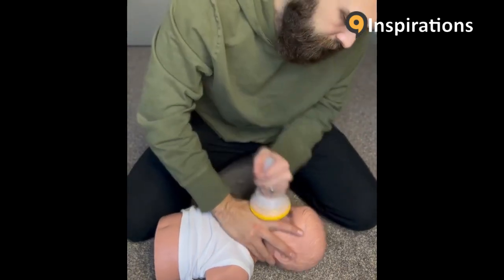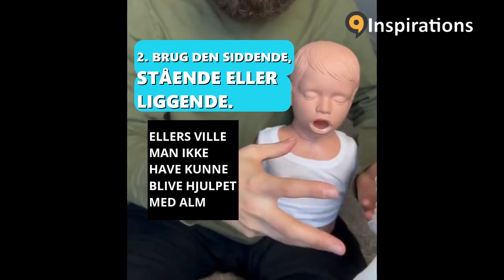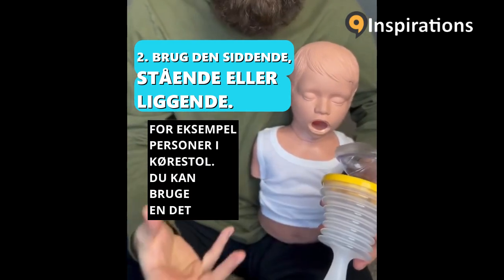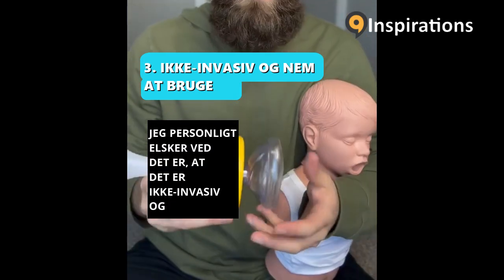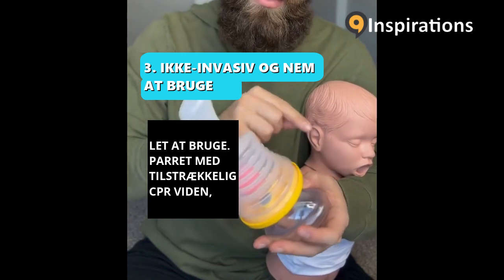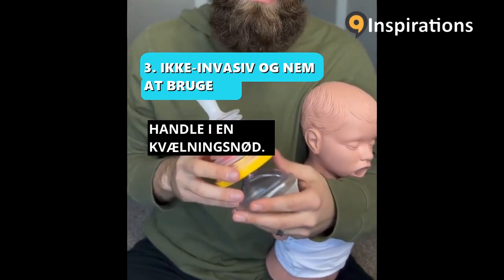What's cool about LifeVac is you can help people that otherwise wouldn't have been able to be helped with normal CPR choking intervention. For example, somebody in a wheelchair — you can use LifeVac for somebody sitting up, standing up, or laying down. It's non-invasive and easy to use. Paired with adequate CPR knowledge, you have an amazing plan to be able to take action during a choking emergency.